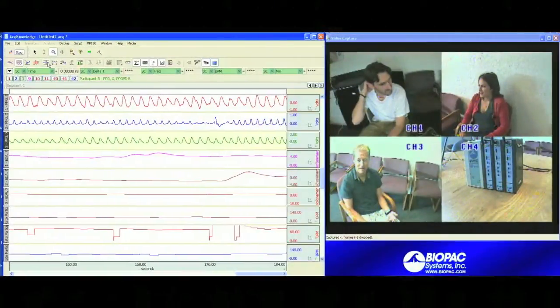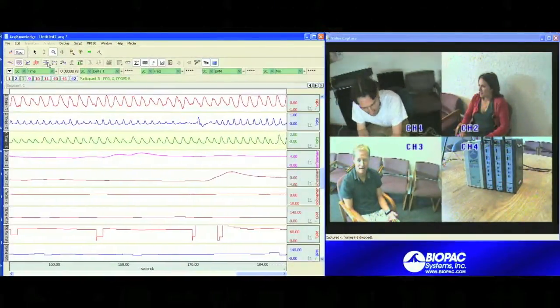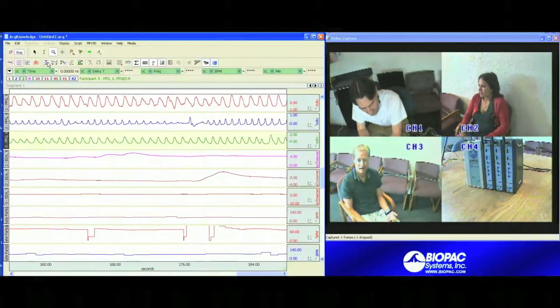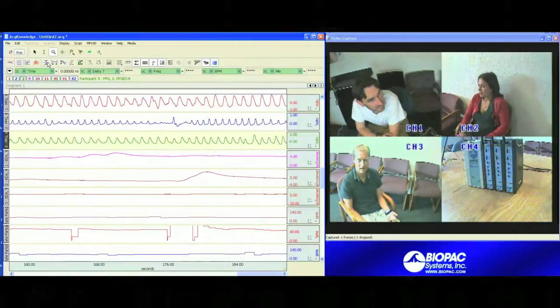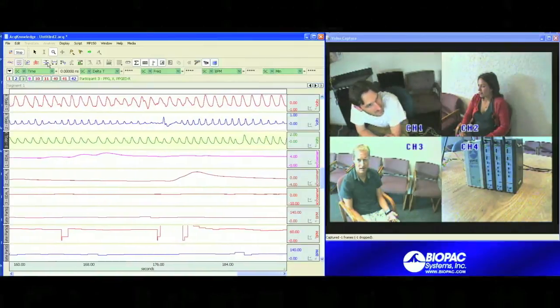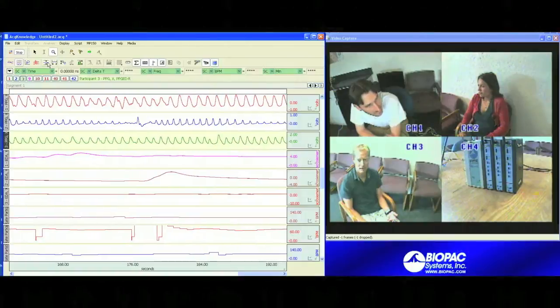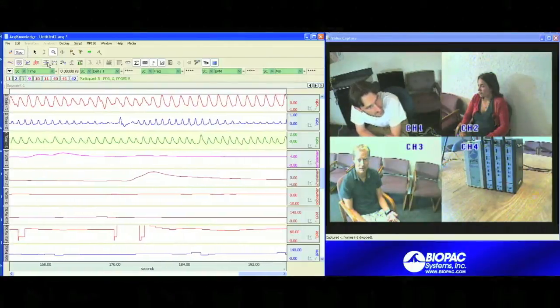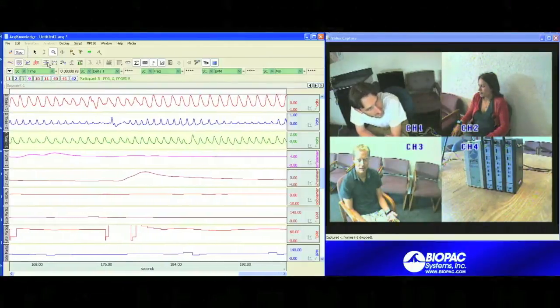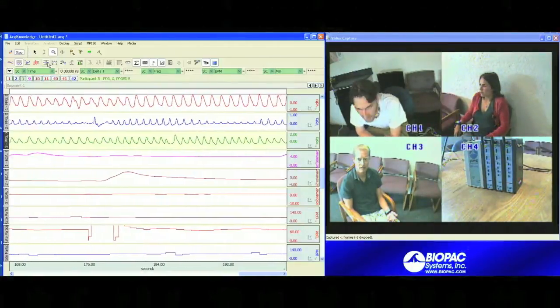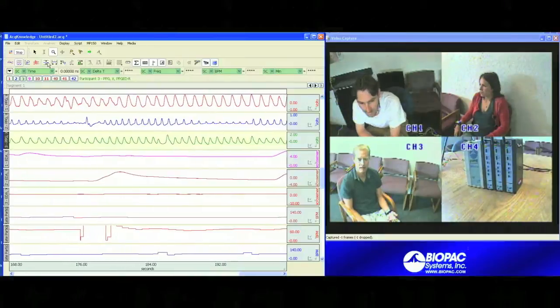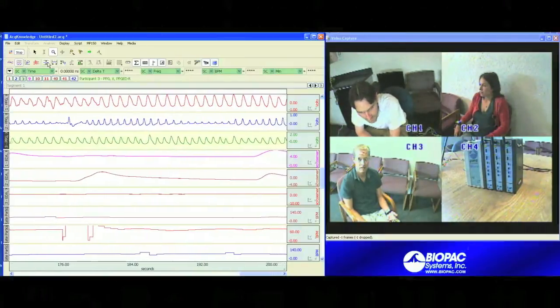Here you can see the live data being recorded from our 3 participants. On the right hand side of your screen you'll see the video capture window showing the 4 camera views. On the left hand side of the screen you'll see the Acknowledge software capturing the pulse, skin conductance, and pulse rate data from each of our participants.